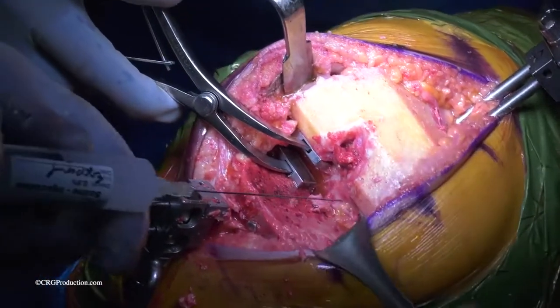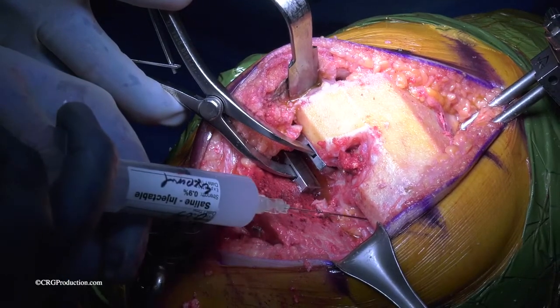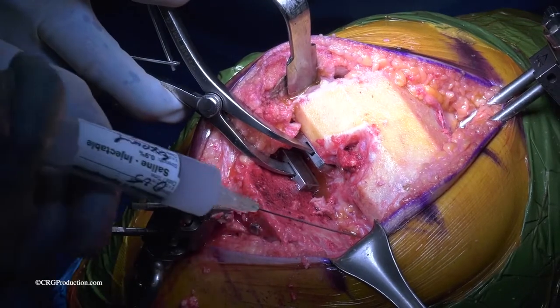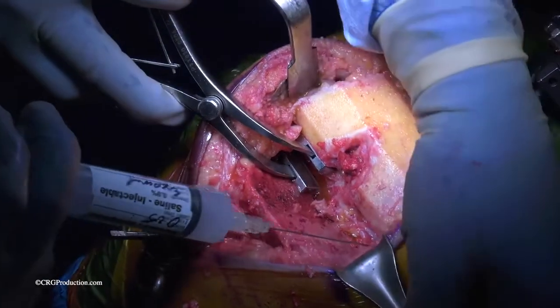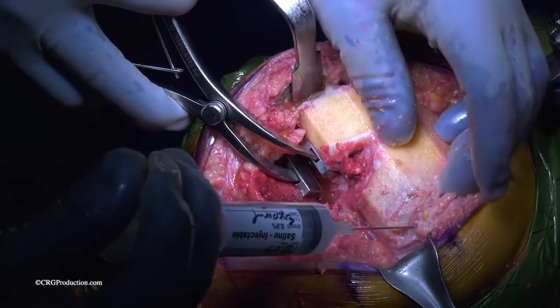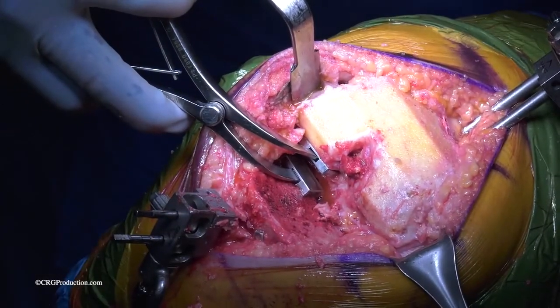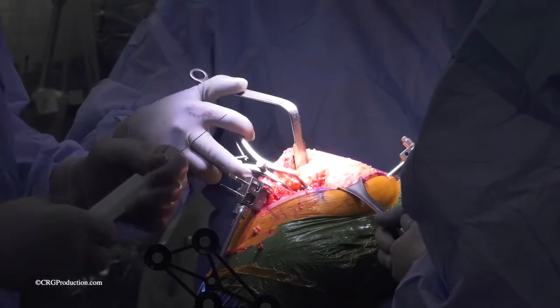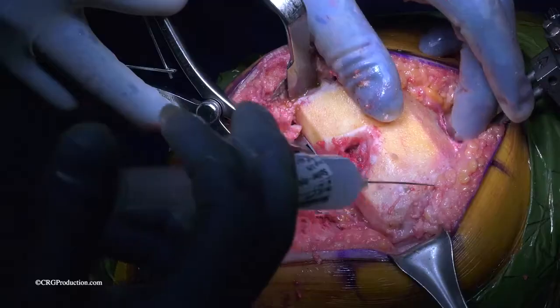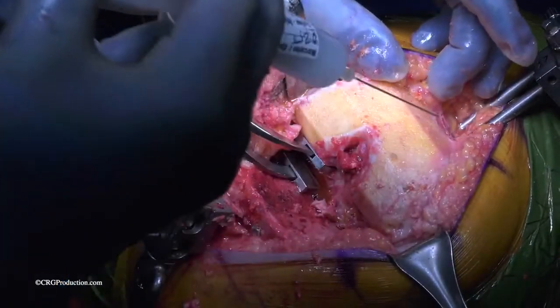In order to decrease the patient's pain postoperatively, we do inject the entire knee with a solution of a long-acting Novocaine. This medication is called Exparel. Using this medication has been what they call a game changer. It allows the patient to stand later today, walk down the hall, and move around. Keeping patients moving is our goal because it prevents leg clots and other problems.